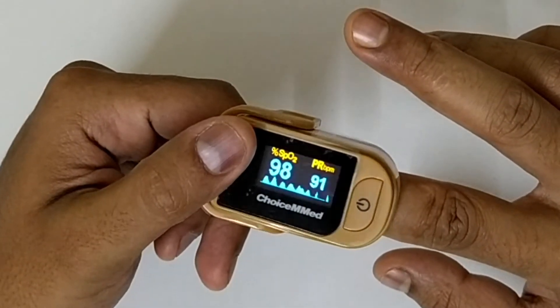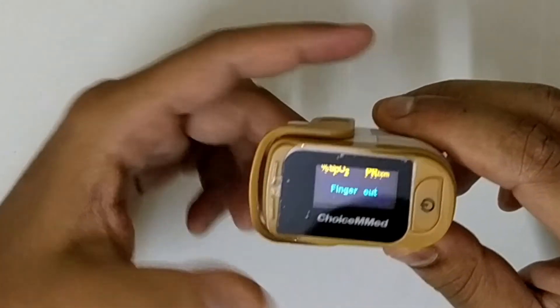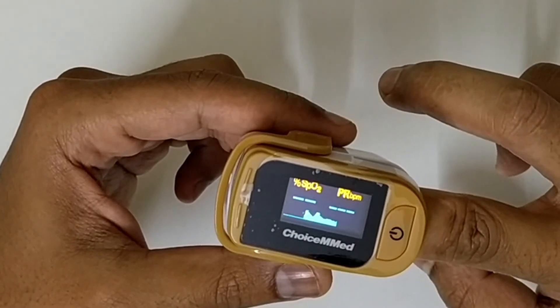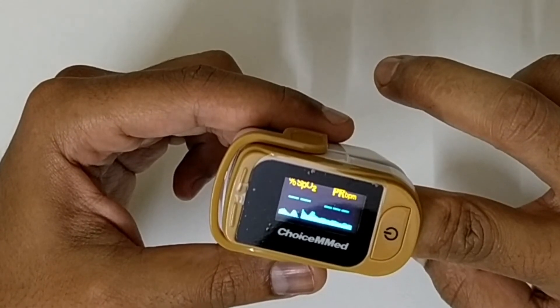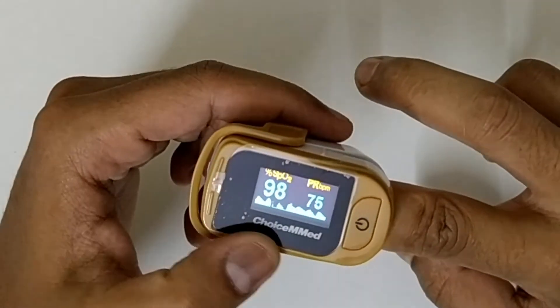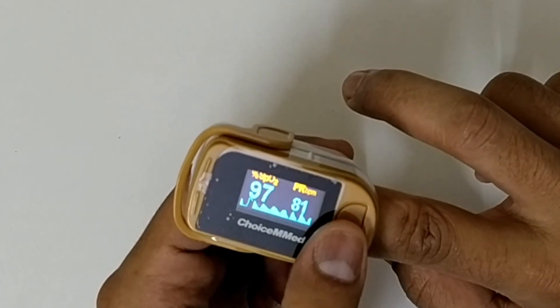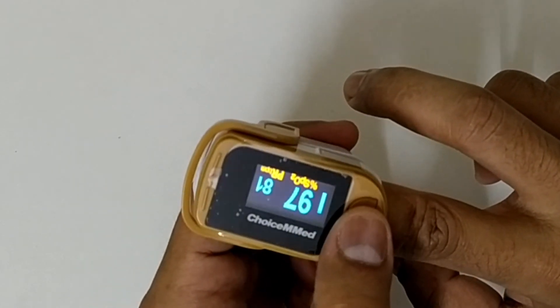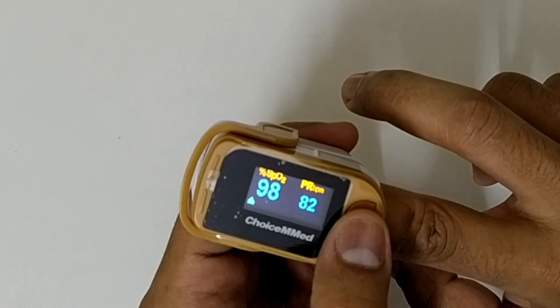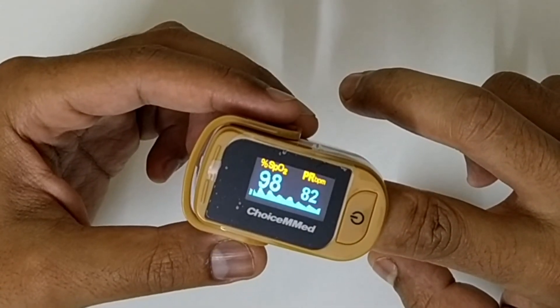As soon as you remove your finger it shows 'finger out,' and as soon as you put it back in it starts reading again within a couple of seconds. It is a live feed, so every few seconds it will update the reading. If you press the button, it will show a different view so you can choose the animation or a different font size.